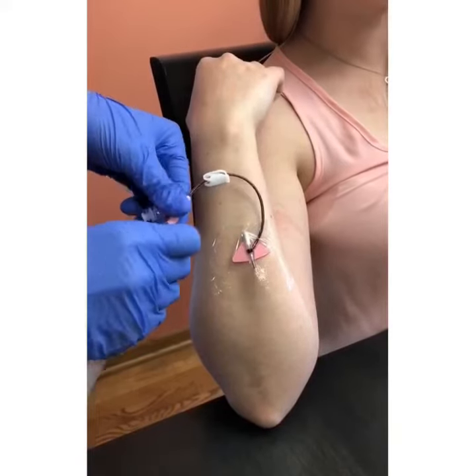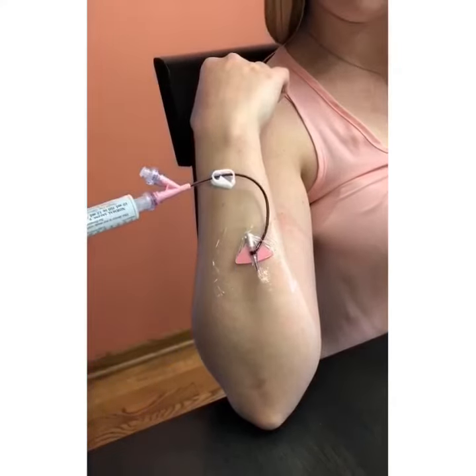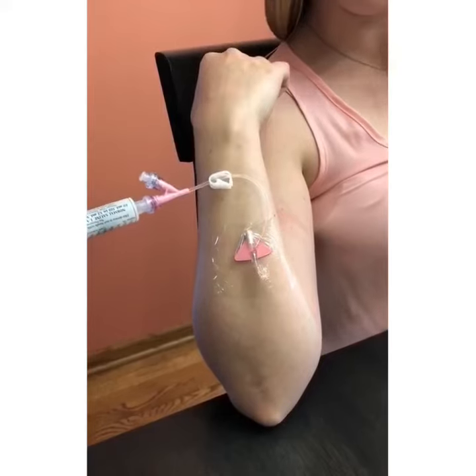And of course you always want to assess for IV patency before you begin an infusion through the IV. This can be done by flushing with 10 ml of normal saline.